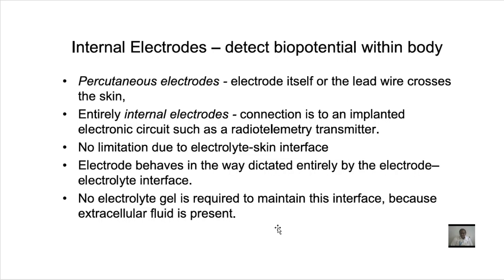No limitation due to electrolyte skin interface. In the surface electrode we are using the gel to reduce the resistance of the skin. In this case, there is no limitation due to the electrolyte skin interface. The electrode behaves in the way dictated entirely by the electrolyte interface.